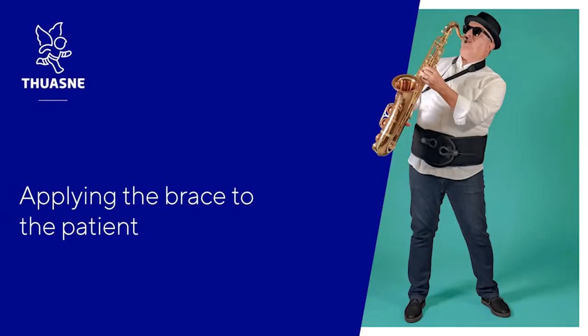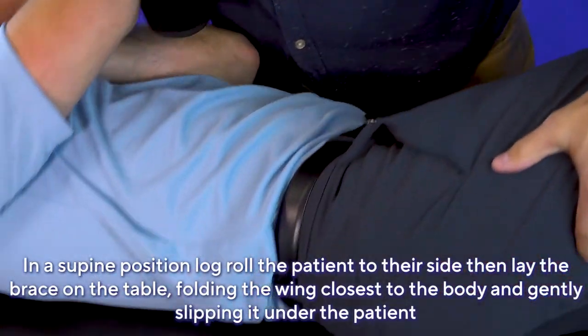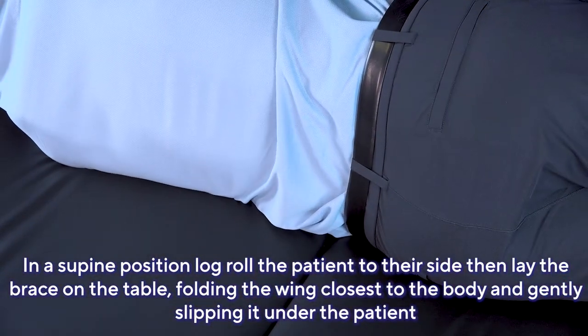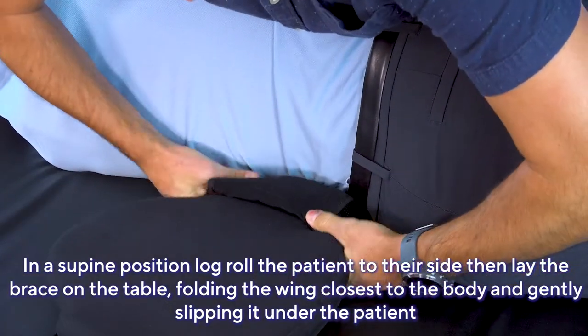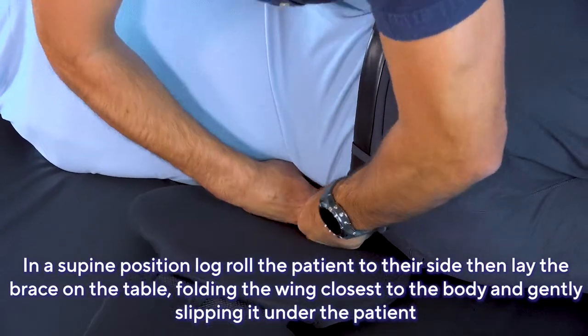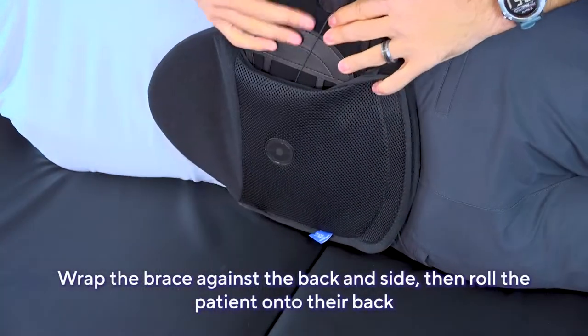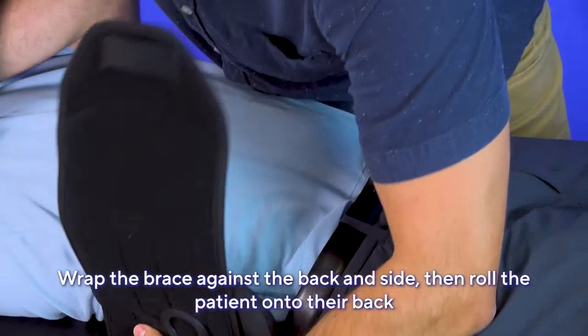Applying the brace to the patient: In a supine position, log roll the patient to their side, then lay the brace on the table, folding the wing closest to the body and gently slipping it under the patient. Wrap the brace against the back and side, then roll the patient onto their back. Slide and unfold the wing from under the patient.